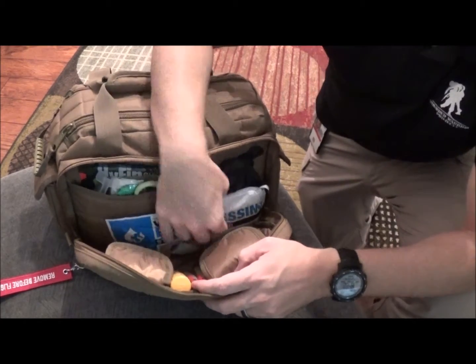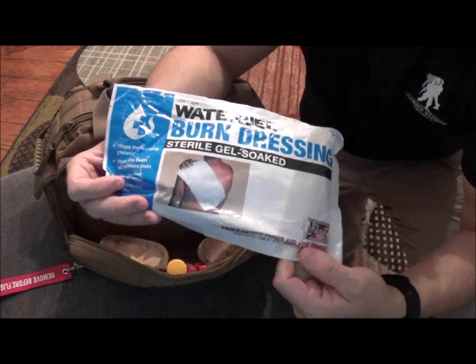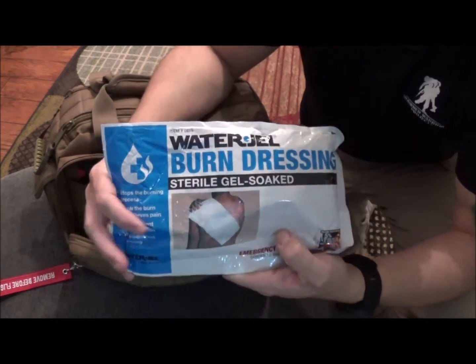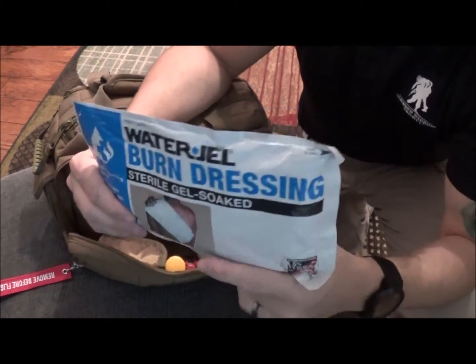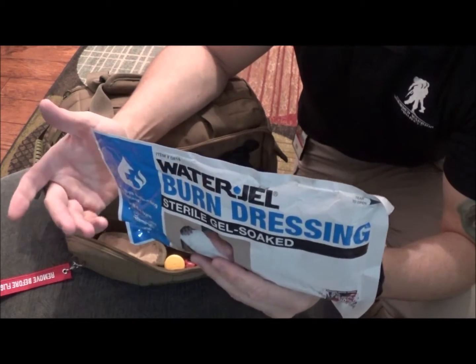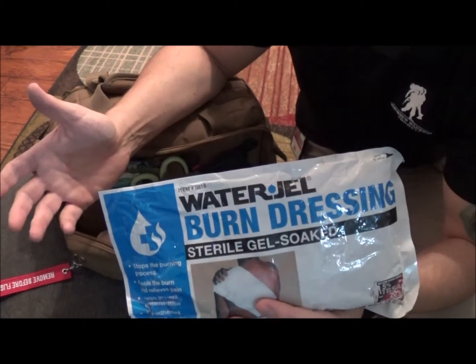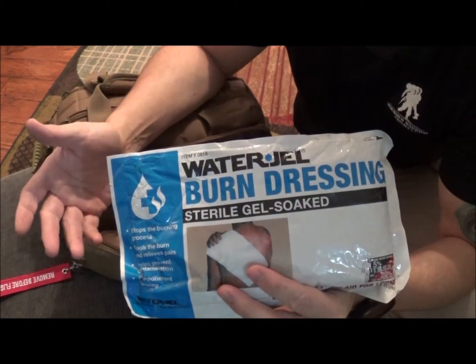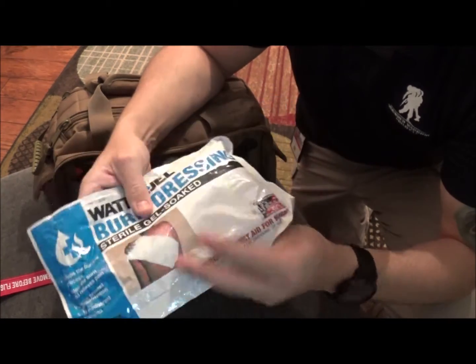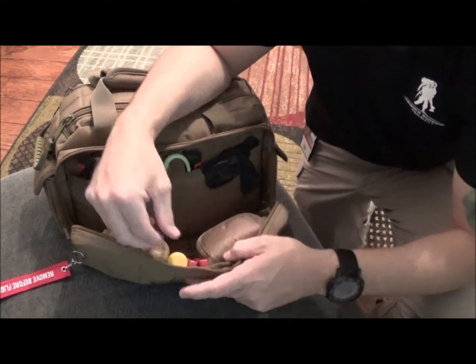Here we've got, this is what they actually use for burn victims, okay? Again, a lot of this stuff is really just to make that patient more comfortable until advanced help arrives, your EMTs, to take them to a more advanced care facility, okay? But if you happen to be on a retreat, maybe it's a camping trip with your family and somebody gets seriously burnt, you can put this dressing on them to help them, okay? You can cut it in two if you needed to treat multiple areas.